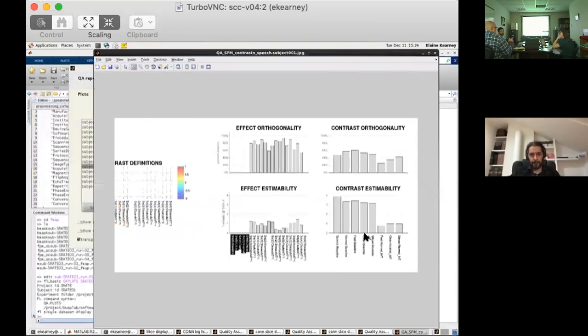Okay, so we got running this with changing the direction of phase encoding for the rest of the subjects, and then running it without the duration covariate. It's kind of a bummer to go back to that, but it would be pretty interesting here because it's a huge difference. It would be nice to look at that just to see.